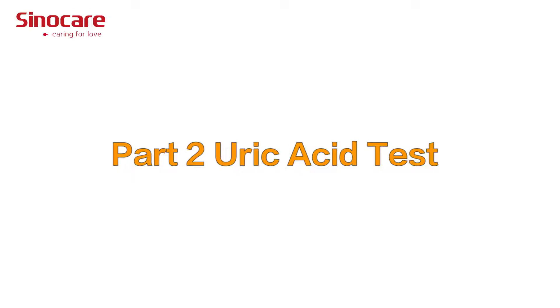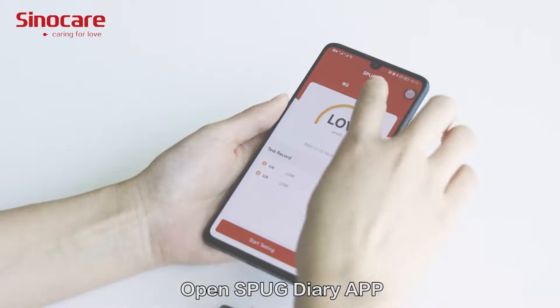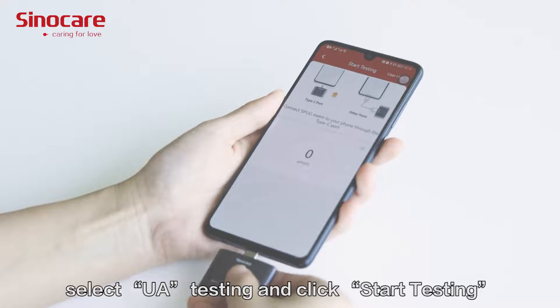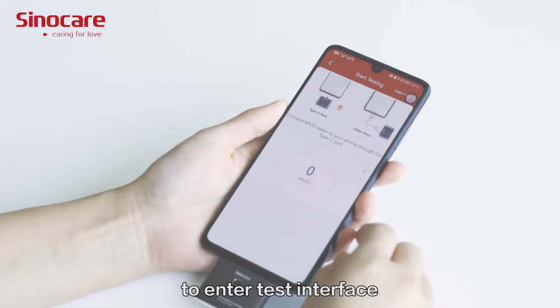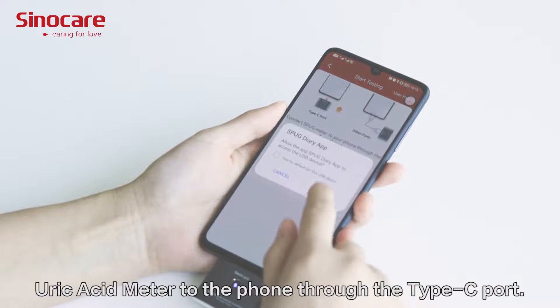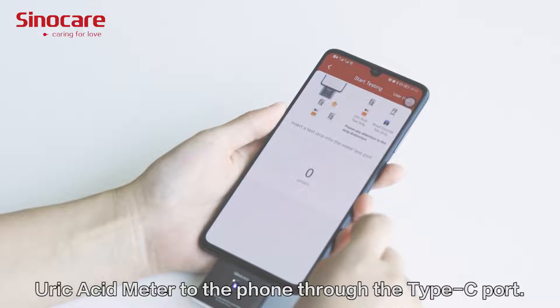Part 2: Uric Acid Test. Open the SPUG Diary app, select 'UA Testing,' and click 'Start Testing' to enter the test interface. Connect the SPUG Blood Glucose and Uric Acid Meter to the phone through the Type-C port.